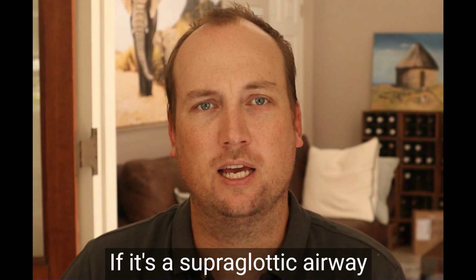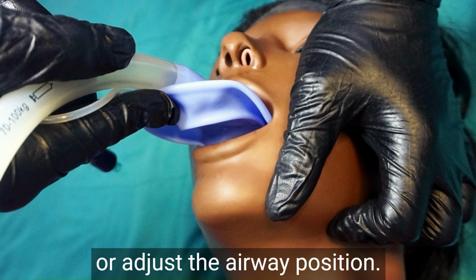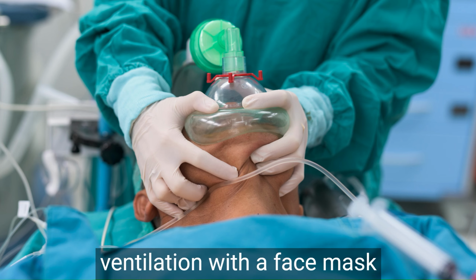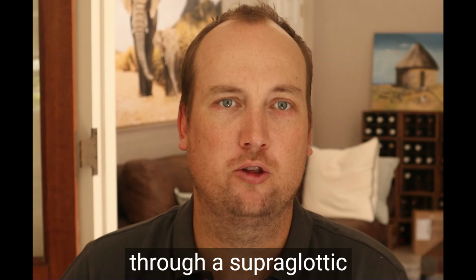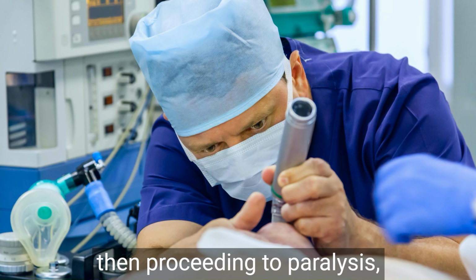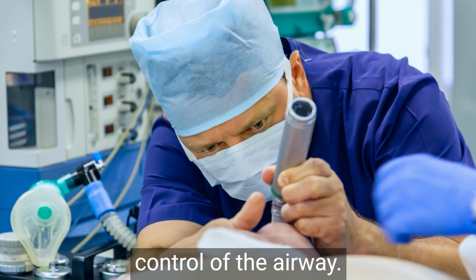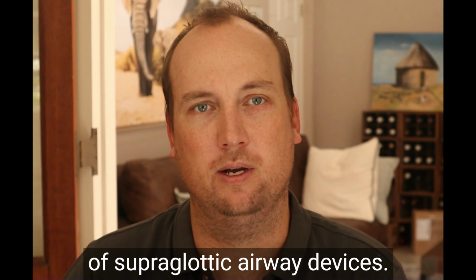If it's a supraglottic airway, I might want to resite the airway or adjust the airway position. I have a very low threshold for recommencing bag mask ventilation with a face mask if I am struggling to ventilate through a supraglottic airway with a leak, and then proceeding to paralysis, intubation and ventilation and re-establishing control of the airway. That's specifically in the use of supraglottic airway devices.